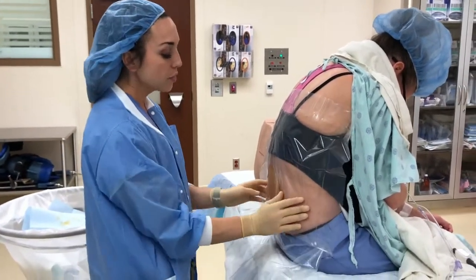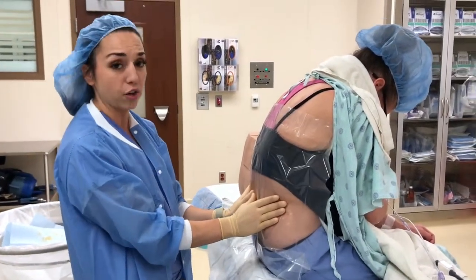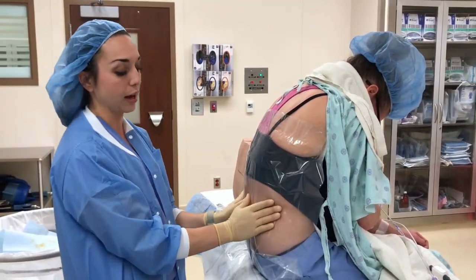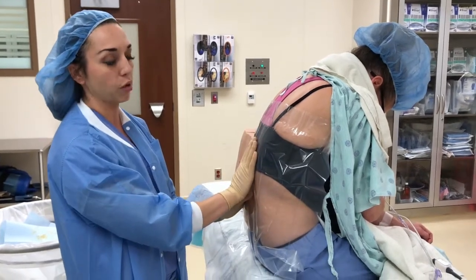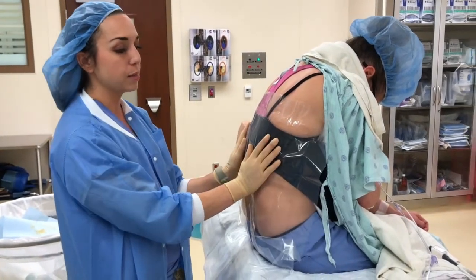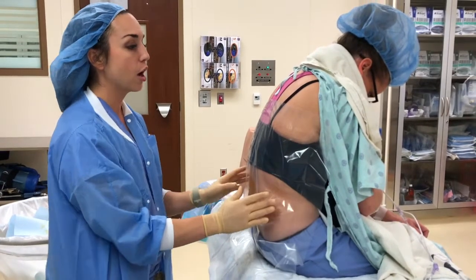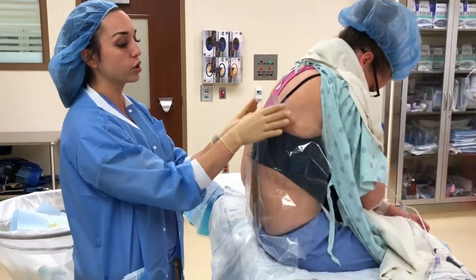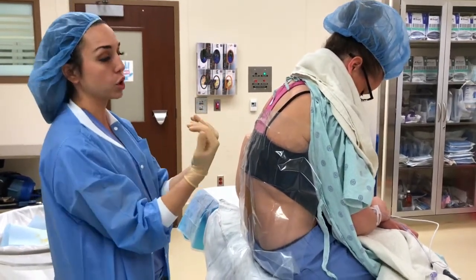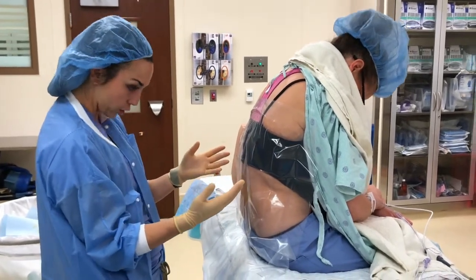Usually at this point, I tell them that this is when I will, again, feel their anatomy. I usually feel before, when I'm not sterilely gloved, and then also when I have a sterile glove. This is when you can gently remind them to assume their position, which is a good time to talk about that position. The best position for epidural, spinal, any of these neuraxial procedures is one in which the parturient's shoulders are nice and relaxed down. Many times your nurse will be standing in front helping bring those shoulders down. We can tell them to tuck their chin into their chest and roll their back down.